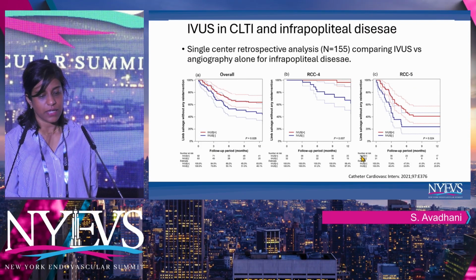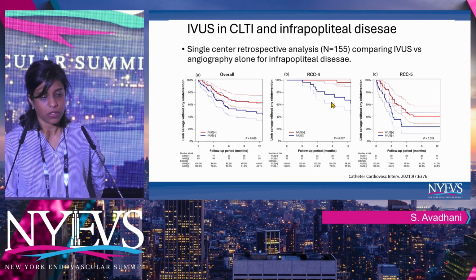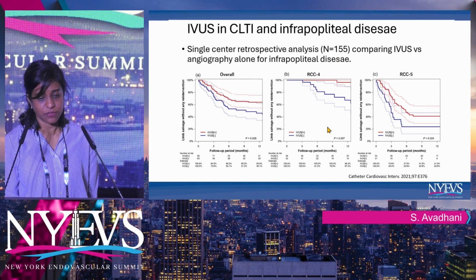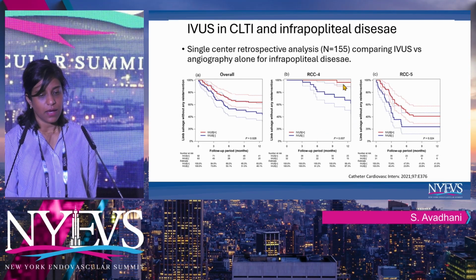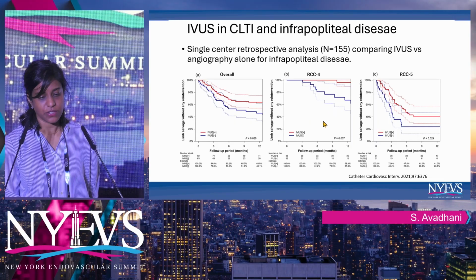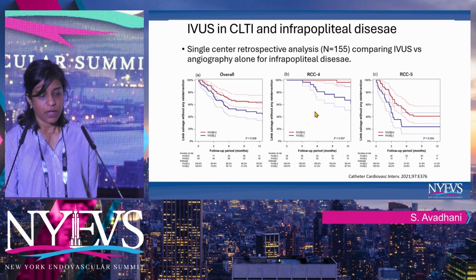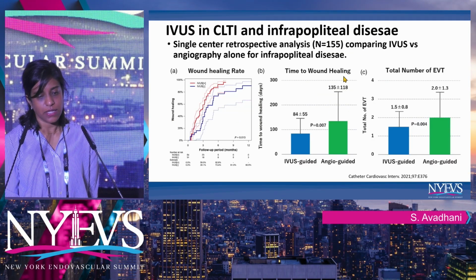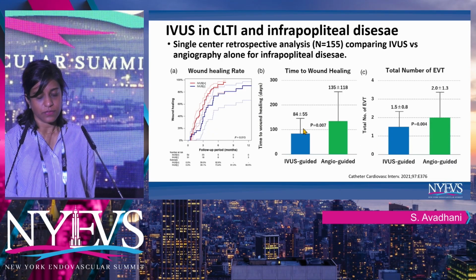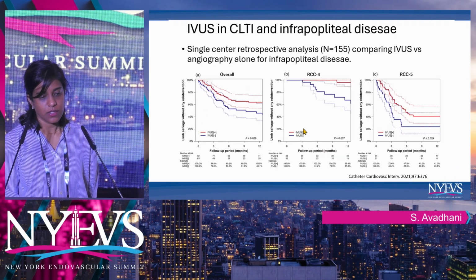And again, a couple more retrospective studies, smaller subgroups, 150 patients, the same theme in Rutherford 4 and 5. Again, IVUS-guided interventions are associated with better wound healing and time to wound healing as well, and a lower number of reinterventions.